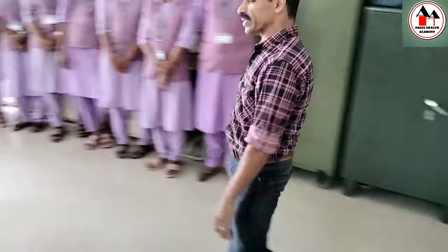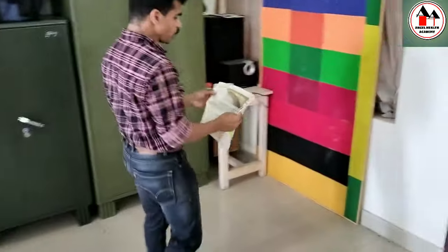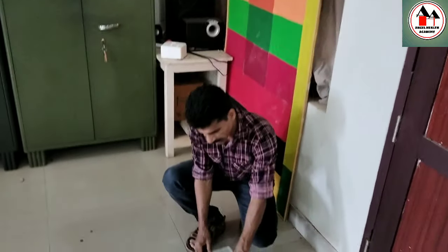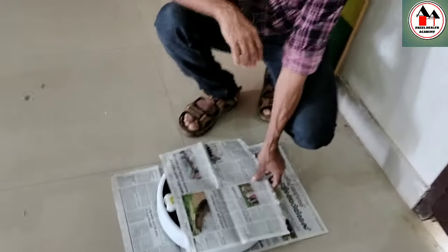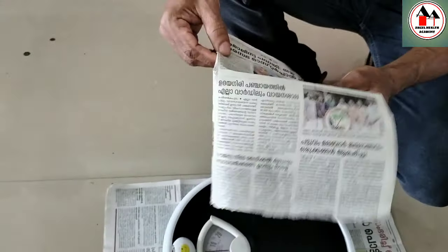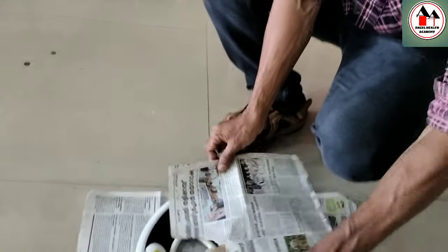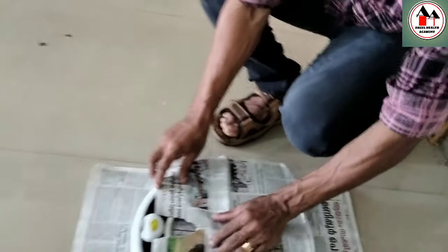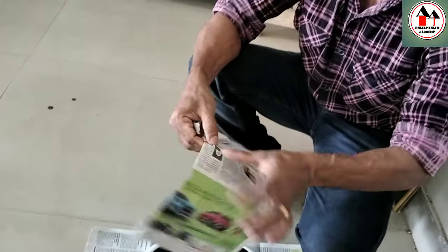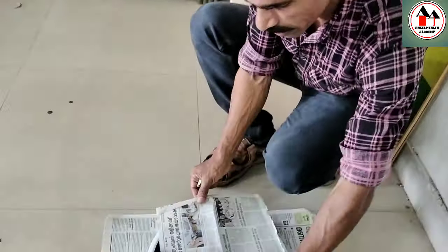Second, you have to protect the top platform of the weighing machine with paper. Take one piece of paper and place it so it is not over-extended beyond the platform edges. You can fold the paper and tear a small piece from the area where the reading scale is, so that when you open the paper you can still see the reading of the weighing machine. Tear it according to the size of the reading scale so the paper completely fits the weighing machine platform.